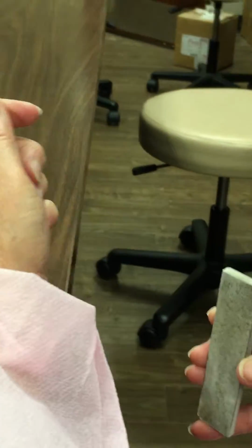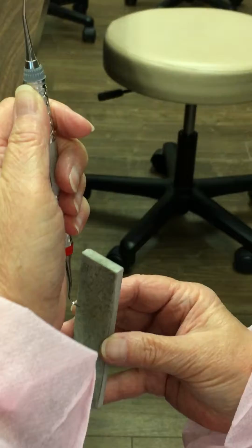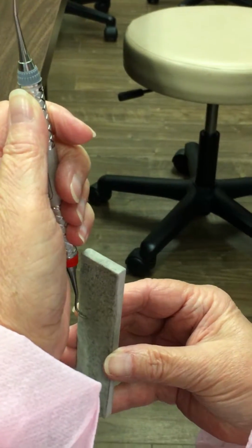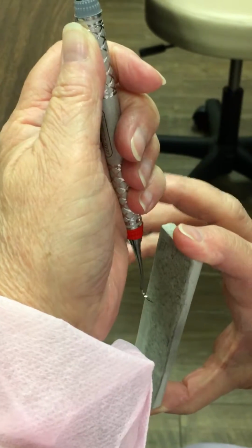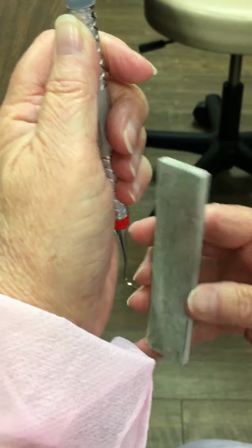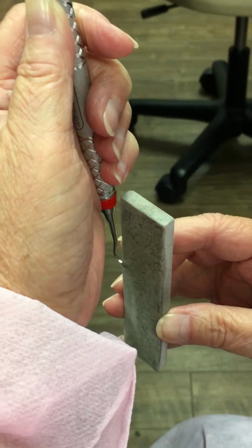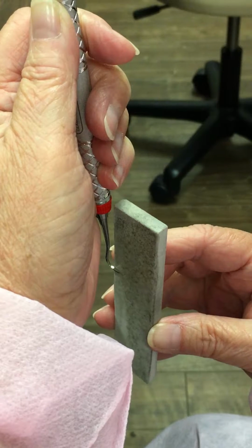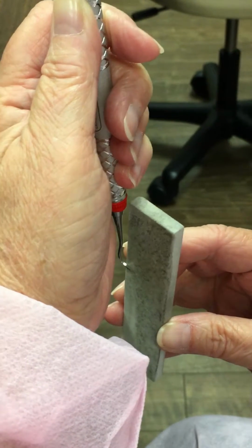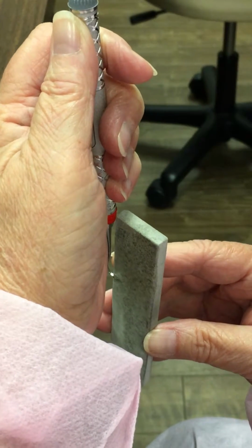I'm holding the instrument in my left hand, kind of in a palm grasp. And my stone, I'm holding like so. You can hold it like this, but that's a little uncomfortable for me, so I tend to hold it like this. You place the stone at 90 degrees to the blade of the instrument, and then you just open slightly so that you achieve 110 degrees.